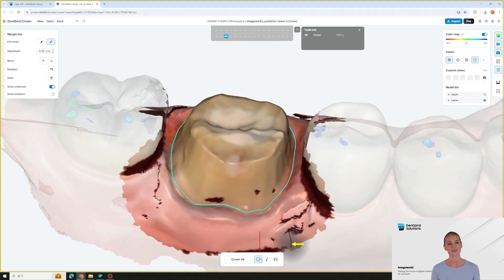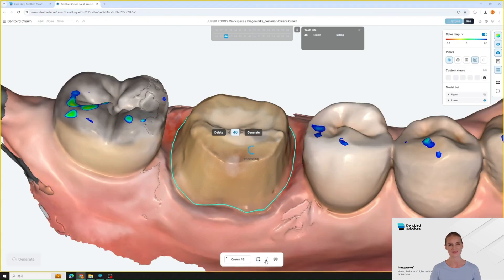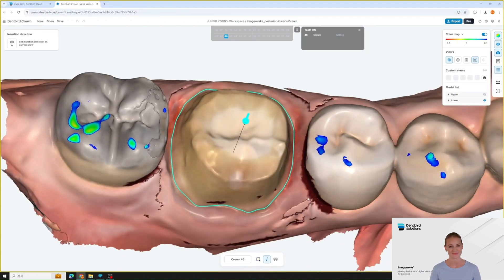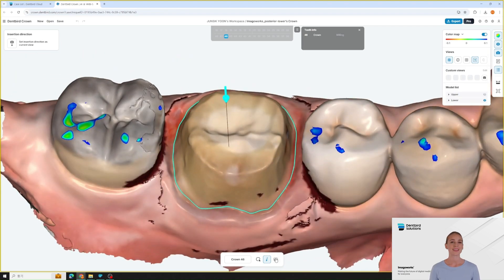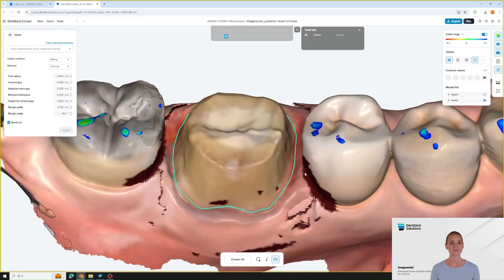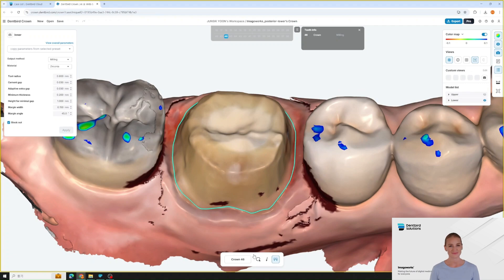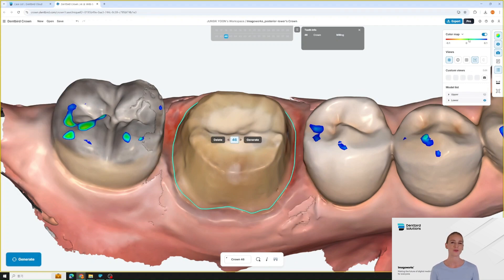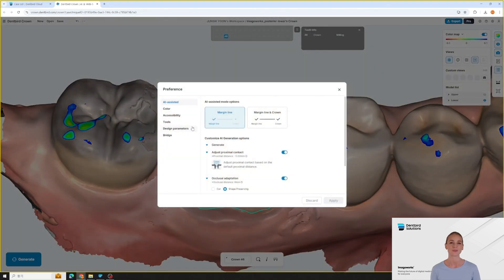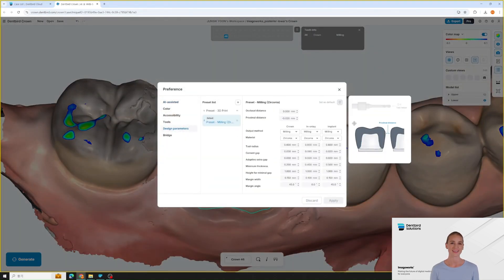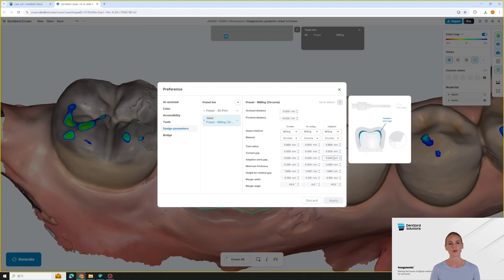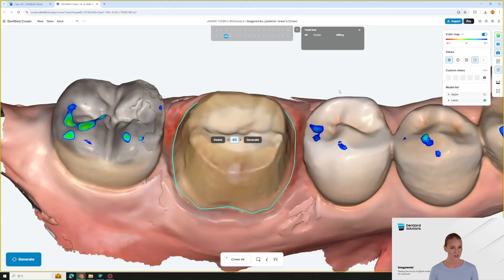You can also set the insertion direction here, and set the inner parameters. If needed, default settings and preference settings can be modified. When you hover over each option, a visual guide appears, helping you understand what each setting controls. You can define cement gap, minimal thickness, and more.